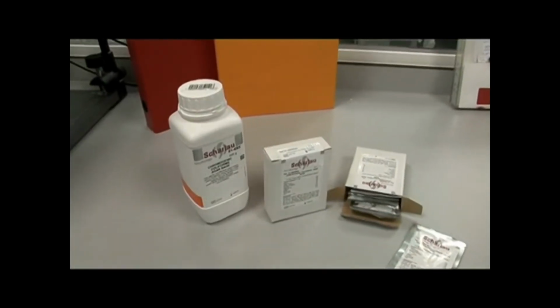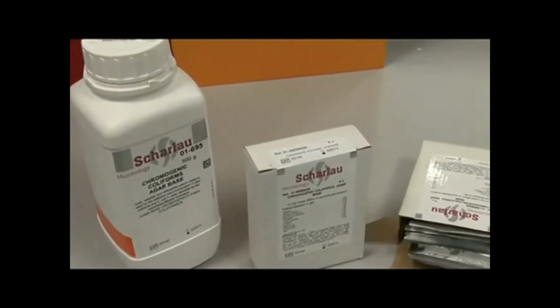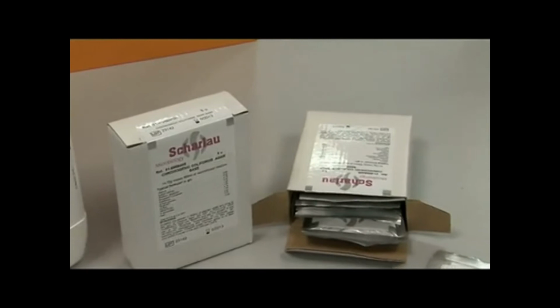Chromogenic medium CCA, chromogenic coliform agar, is a selective culture medium for the detection and enumeration of coliforms and E. coli with an adjusted and precise selective capability, ideal for water analysis. With antibiotics cephalosporin and vancomycin included in its formulation, it gives improved results and recoveries. Compatible with a variety of different membrane brands, using our combination of CCA and coliform CV selective supplement. Formulated according to an alternative method proposed by the Spanish Ministry of Health.